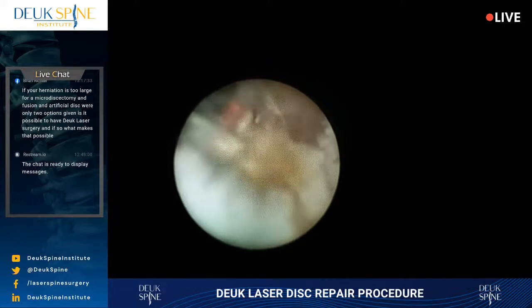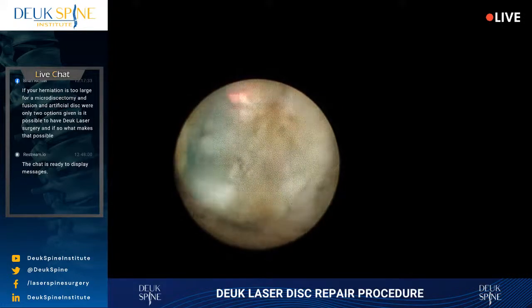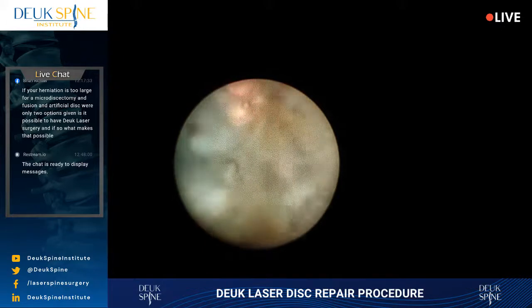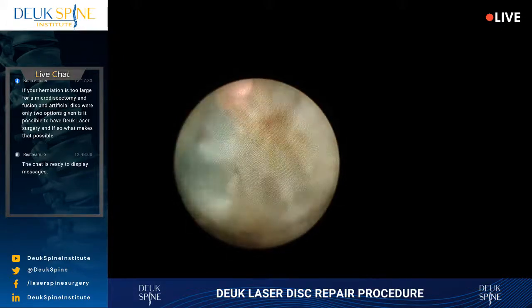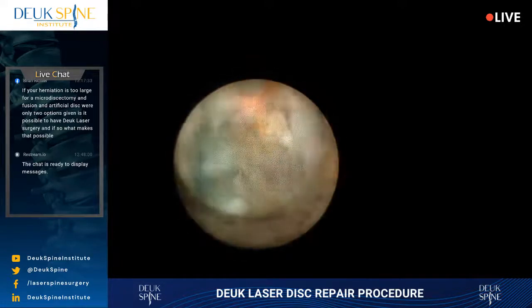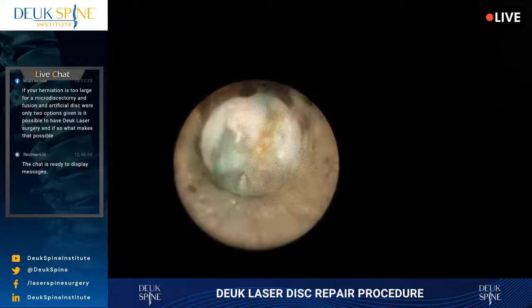And you have to do that super careful. I'll show you how to do that in a minute. First, I'm going to clear out the herniation, what's called subligamentous herniation. It's herniation under the ligament. This stuff's pretty safe and easy to do. As a matter of fact, most cervical disc herniations are subligamentous, and they still cause symptoms.